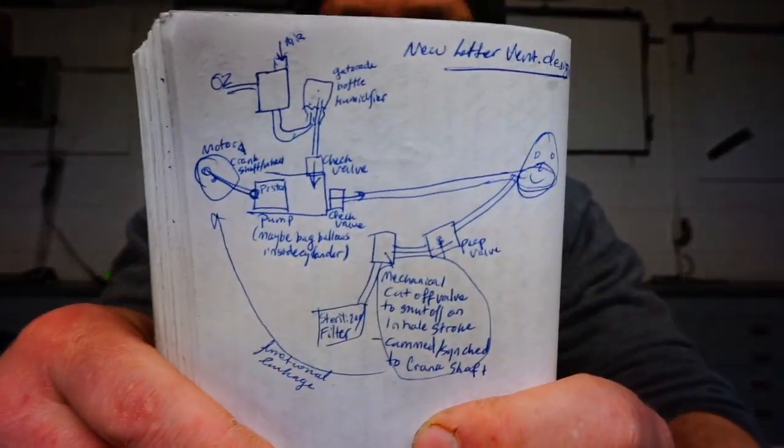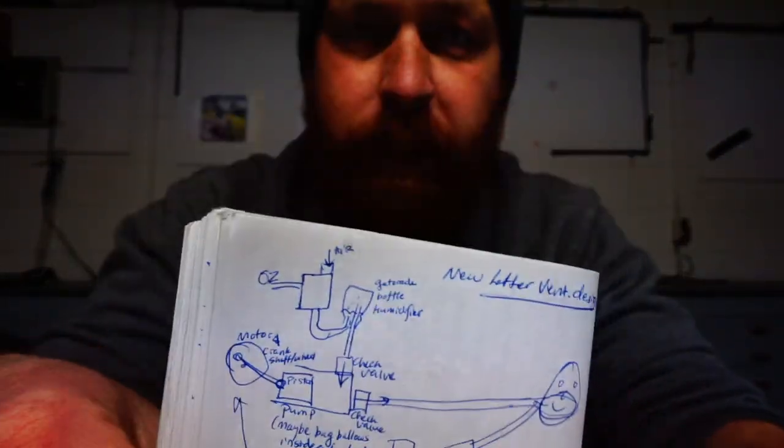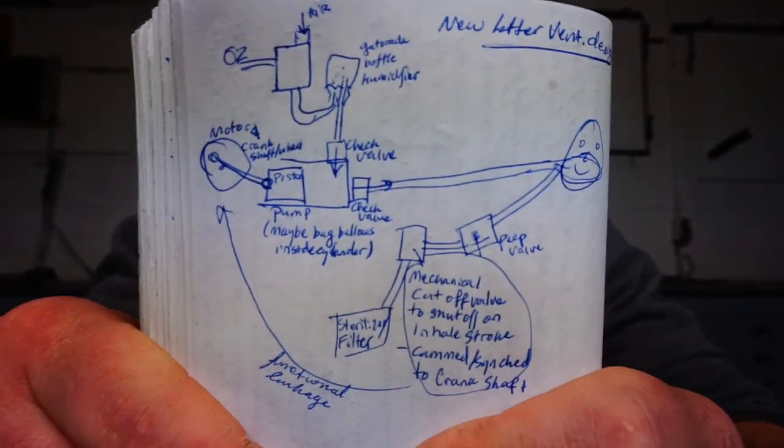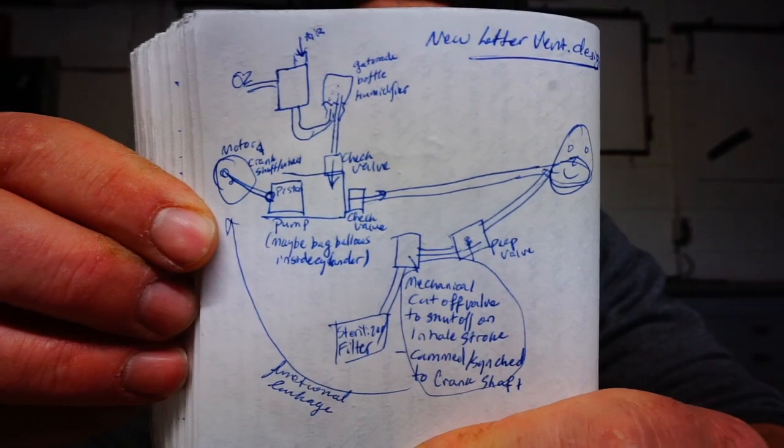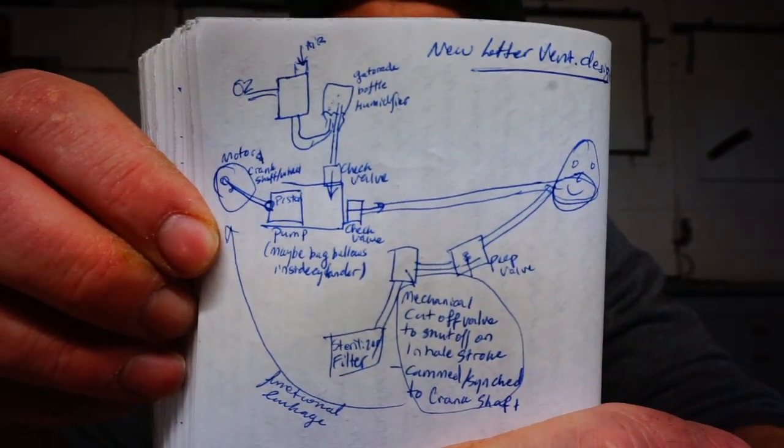So the other day I thought about a two-piston system to push positive air pressure during the exhale cycle. I came up with a much simpler version that I think is much closer to how an actual ventilator works. So this is a functional diagram of the pieces of a ventilator.